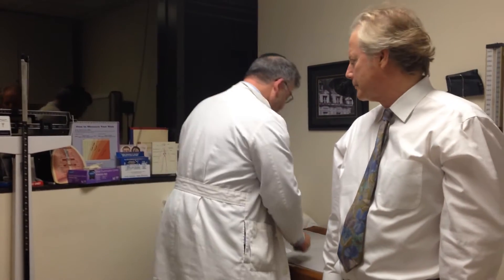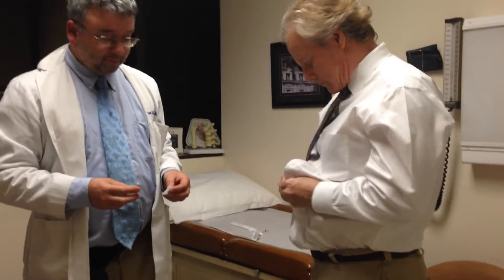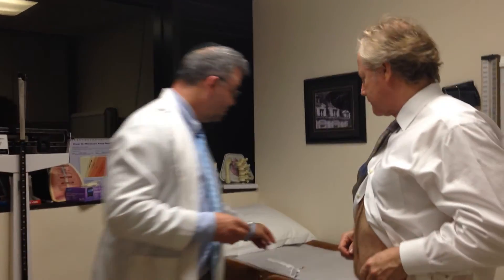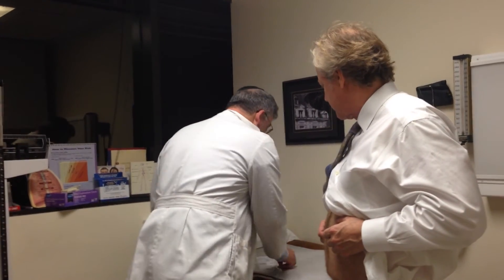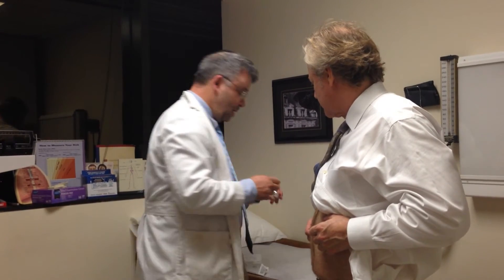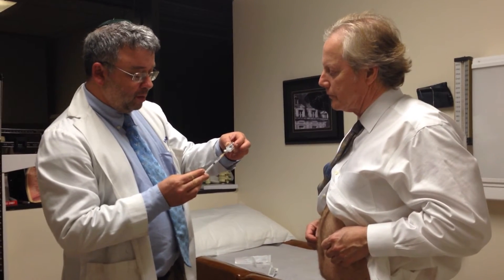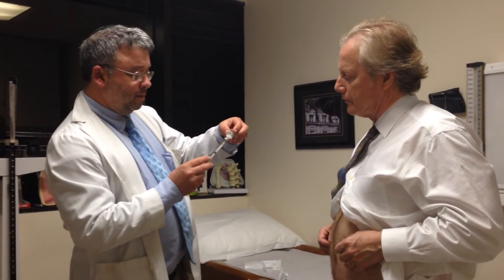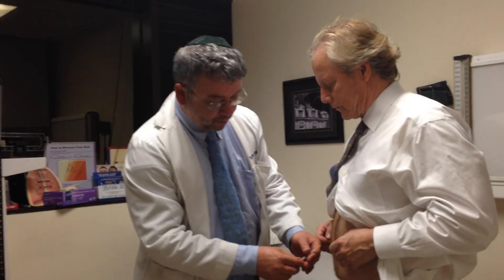So what I'm going to do is show you how to do it. You want to take off your shirt for a second. So you wipe off the top of the bottle like this. You then wipe off your stomach like this about here. And then you take off the needle of the syringe and get the bottle upside down. Push in right here, push out, and then you pull it up until about the 0.5 marker until it's all filled up. Then you can take it out and get rid of all the air bubbles — hide it at 0.5. And then you would do the injection right into your stomach like this.